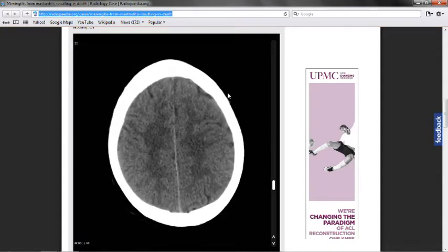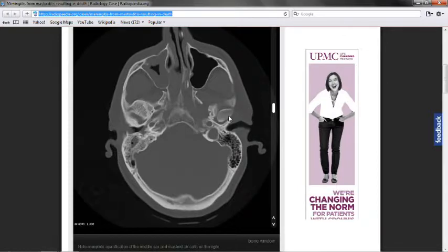And that's pretty much it for meningitis on this 1 week, 1 day later. So while the effects of meningitis sometimes aren't easily seen on the brain, we do see a causation for meningitis.